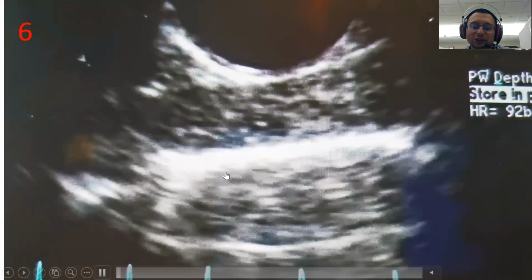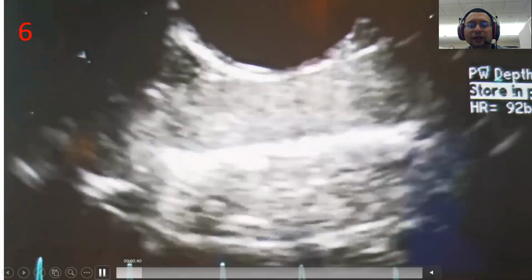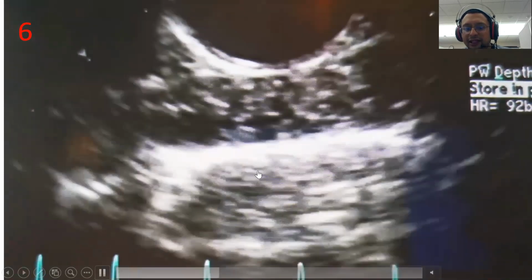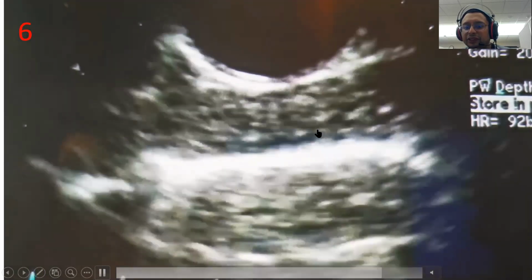Yeah. So I just wanted to show you because in the exam, they like to show you artifact, okay? I wanted to make you understand what is artifact. Actually, this is artifact. This is not a real structure. So this is an artifact of the SVC on top of this.